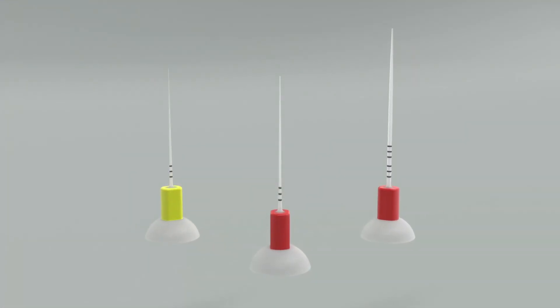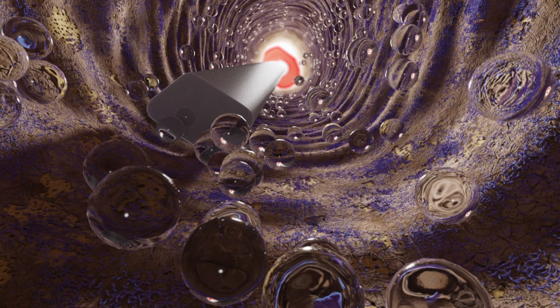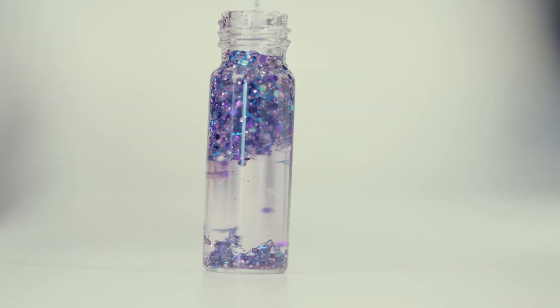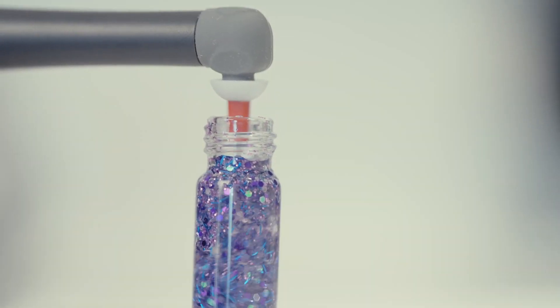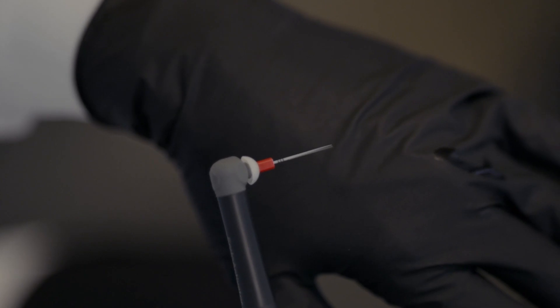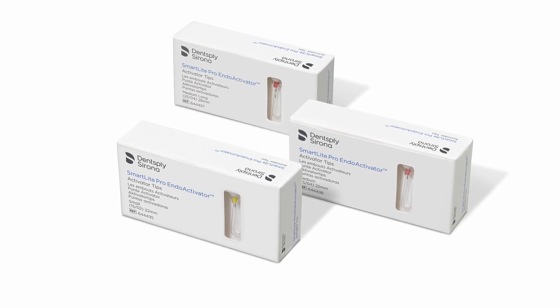The endo activator comes with three different tip sizes. The tip is no longer round — it has some flat sides to it. Using the analogy of an oar in water, it just moves the fluid more efficiently. They've also extended the length of the tips, so we now have a choice for longer canals with a longer tip, which is huge.